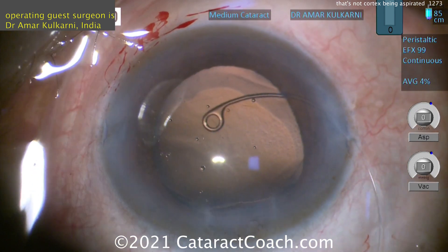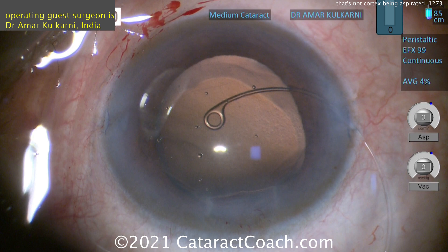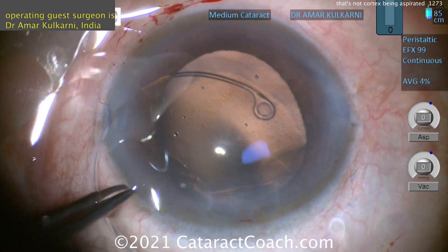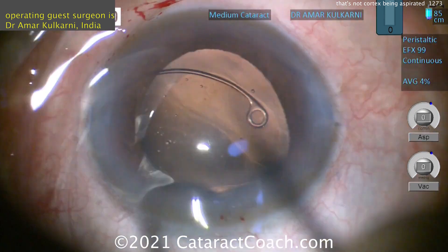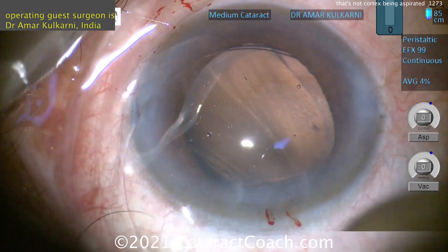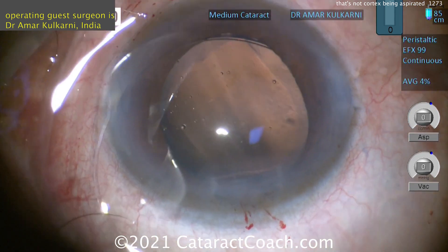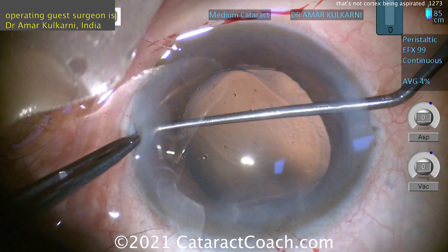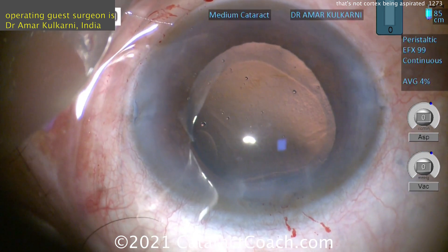So the CTR is being placed manually. I like the position here — starting off away from that area and going in tangentially, following the curve of the capsule bag. That CTR is going to be placed quite gently. Going in, get that into the capsule bag nice and gently, advancing in a controlled manner. You can see the little eyelets on the end — those eyelets can be helpful to use a Sinski hook to get it delivered. You can use a two-handed technique, feeding hand over hand, or one-handed. The trailing arm can be grabbed with that Sinski hook and placed inside the eye, and now it can be gently placed in the capsule bag, providing sufficient support.